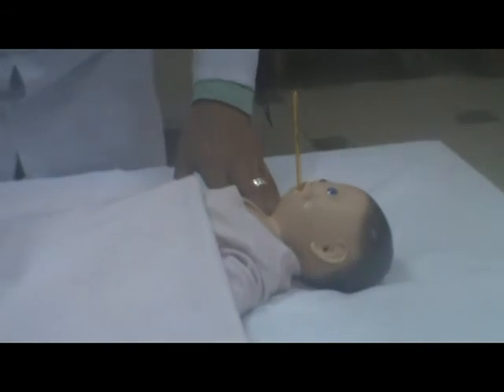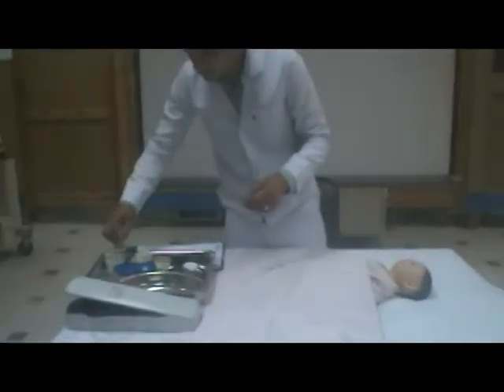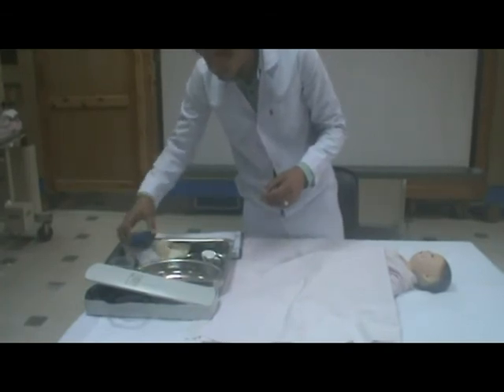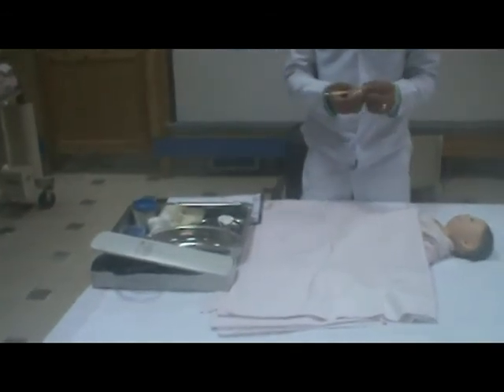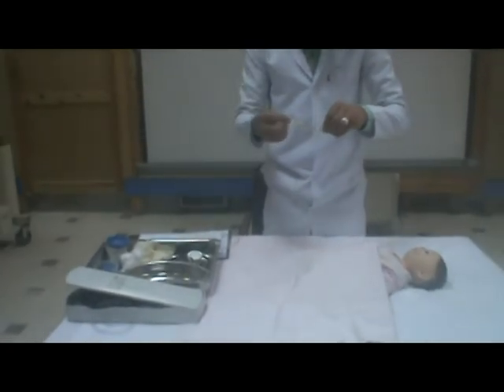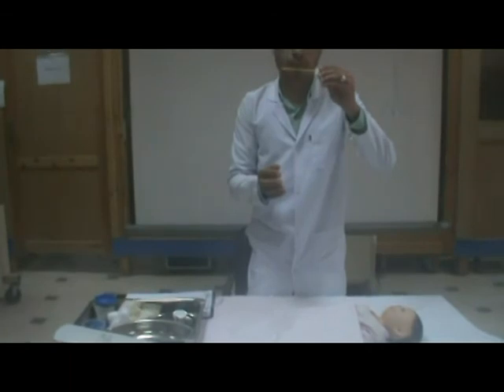Number 6, remove the thermometer. Number 7, wipe the thermometer with dry cotton swabs. Number 8, read the thermometer. Number 9, record the temperature.